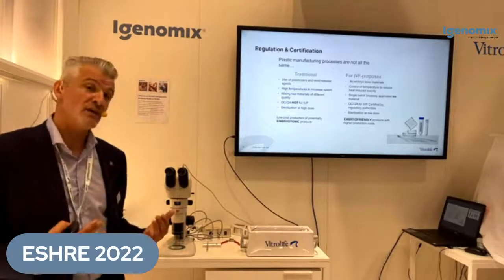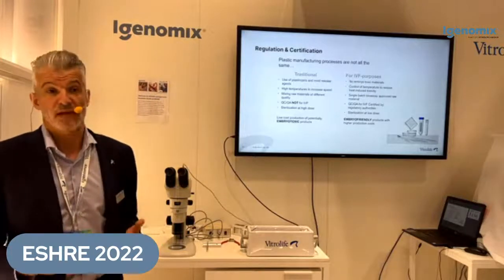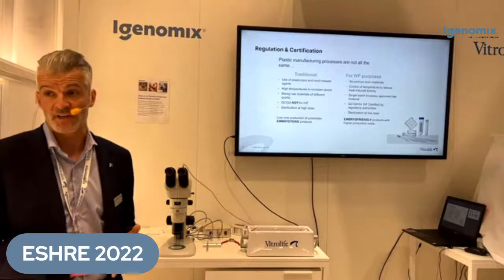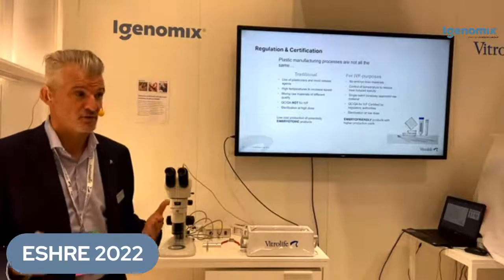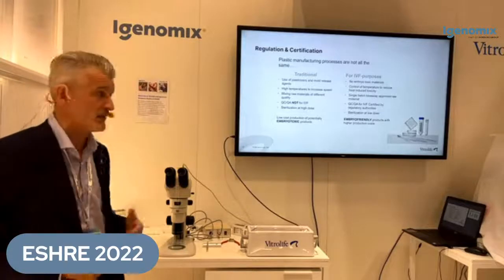Now, in the UK, obviously the Human Fertilisation and Embryology Authority recommend that all IVF labs must use IVF certified CE marked products wherever possible. The only exception to this is if there is no CE marked product available. And this is also encompassed into the good practice regulations as well.